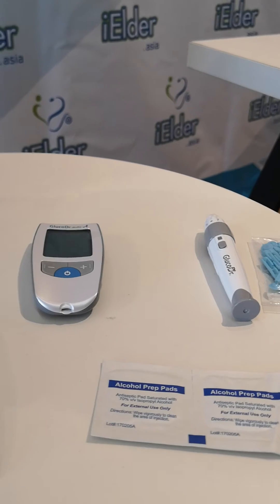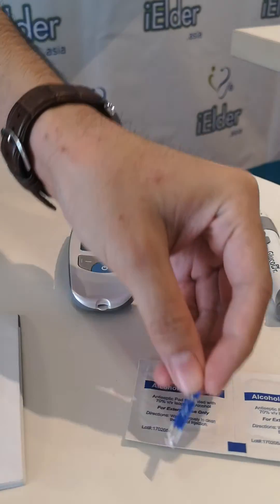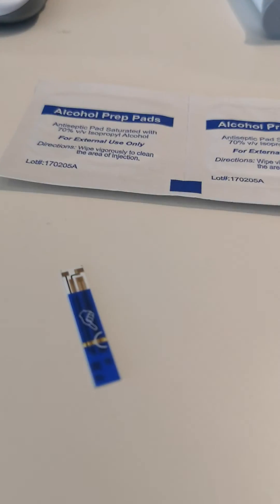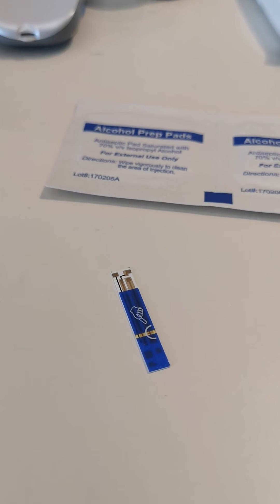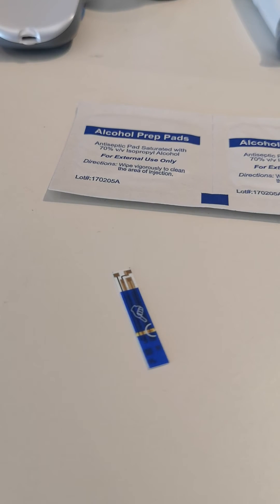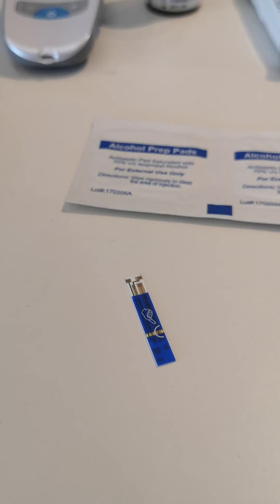The test strip itself uses gold material on it. Basically this translates to better accuracy when the results are being transferred from the strip into the meter. It is also ISO certified by the international organization as well as the European organization.